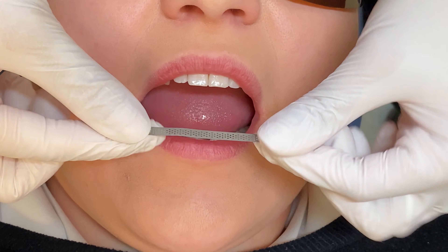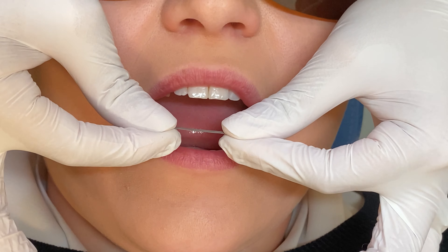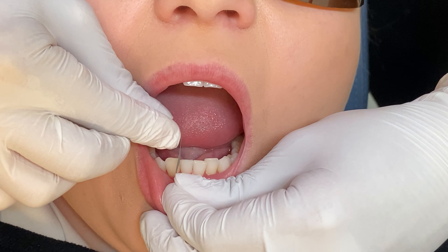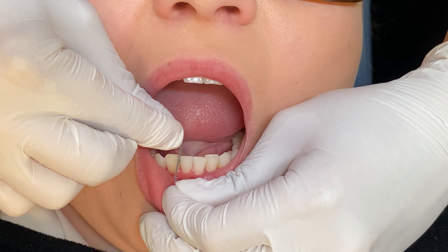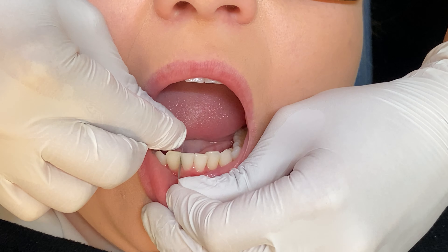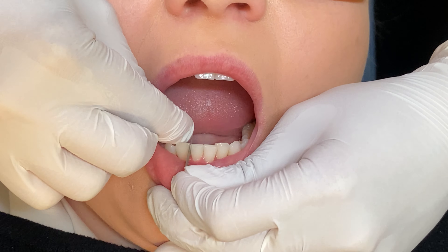If there is a binding contact, you need to use the abrasive strip to create some space. To do this, hold the IPR strip firmly between your index finger and thumb on either hand so that the strip is tight. Gently place the strip between the two teeth, approaching the contact from the biting edge. Apply gentle force toward the gum while moving the strip back and forth until there is less resistance.